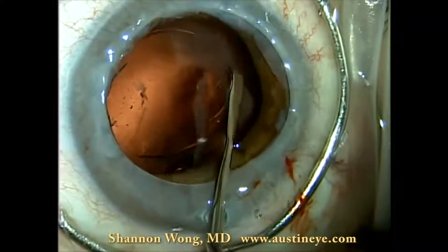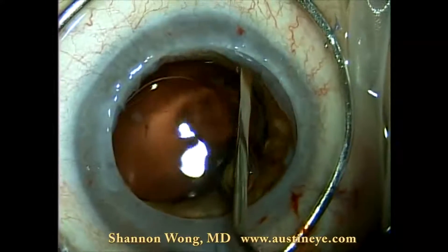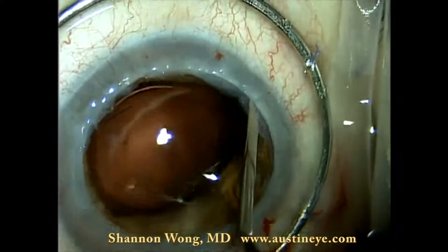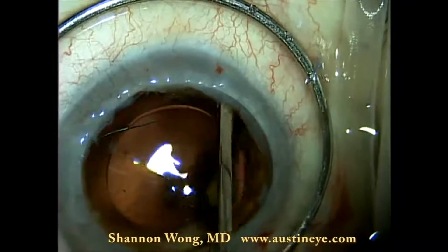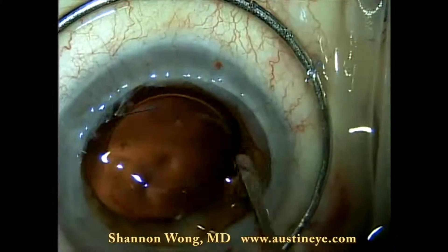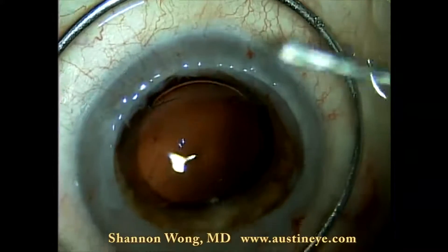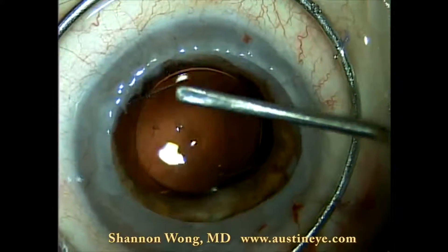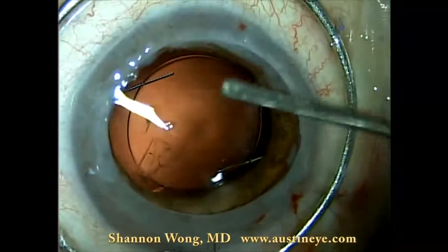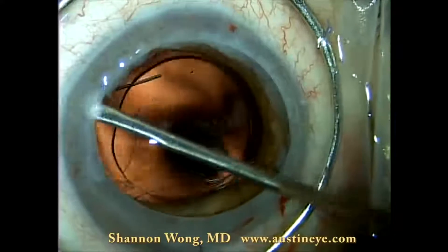The peripheral rim of the host cornea had become inflamed and cloudy, making visualization of the pupillary border — which had become tonically dilated — somewhat difficult. Because we removed the original cloudy donor, we could visualize these structures, but had we tried these maneuvers in a closed system through the original donor cornea, it would have been impossible to safely perform her surgery. Here we can't even see the pupillary border from 9 o'clock to 11 o'clock.